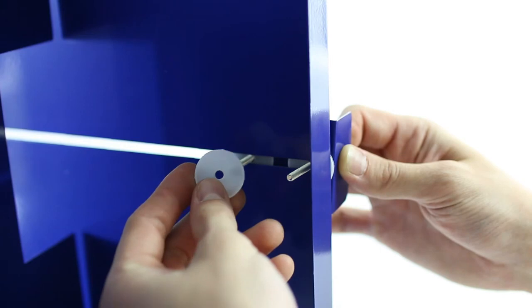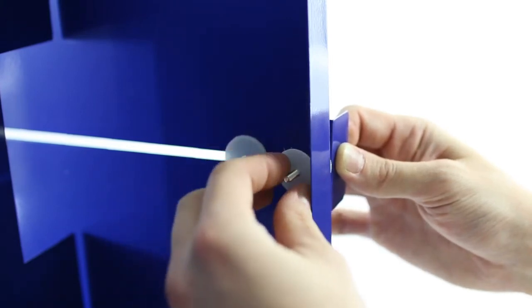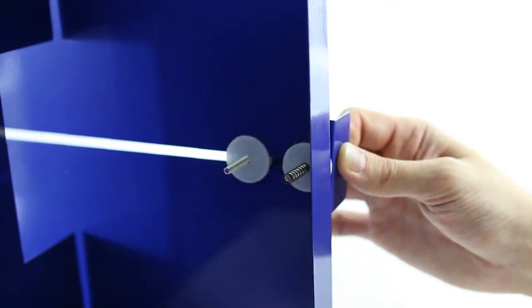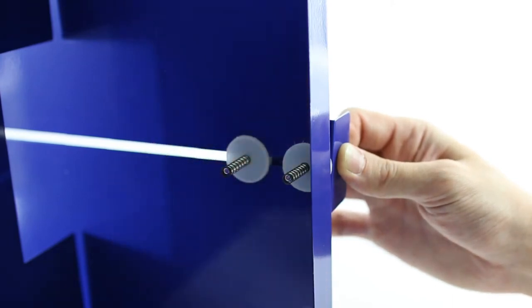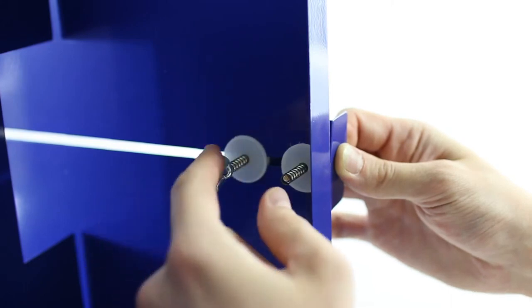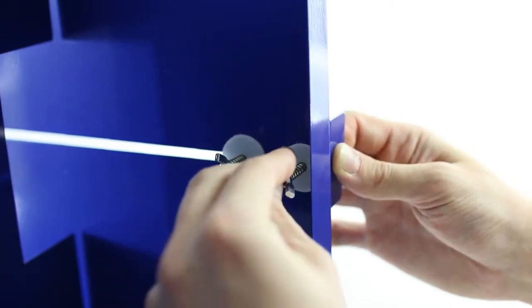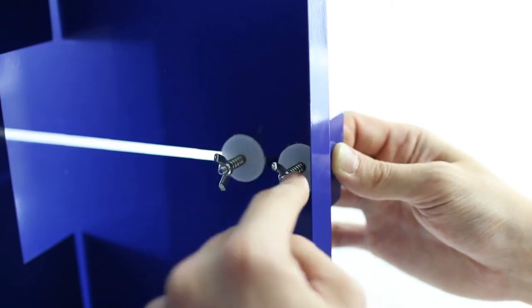Insert another spacer into the screw under the top plate, followed by a spring and then a wing nut. Hand tighten the wing nuts. Adjust tension as needed by tightening or loosening the wing nuts. The slide device provides adjustable levels of friction.